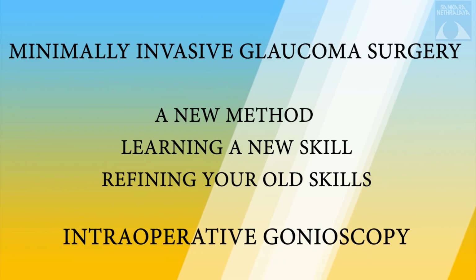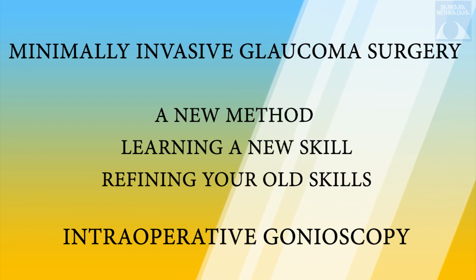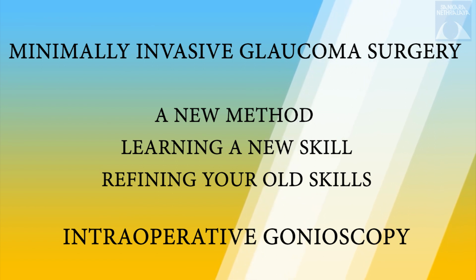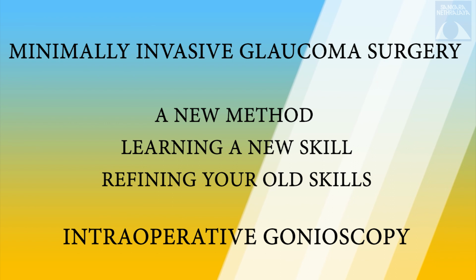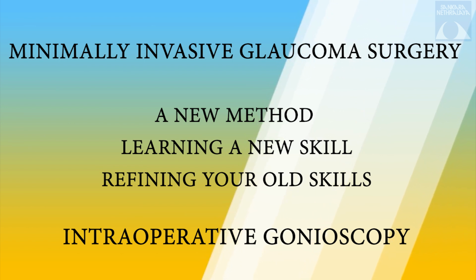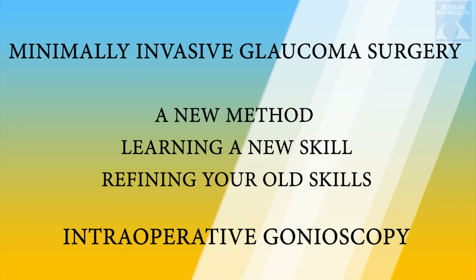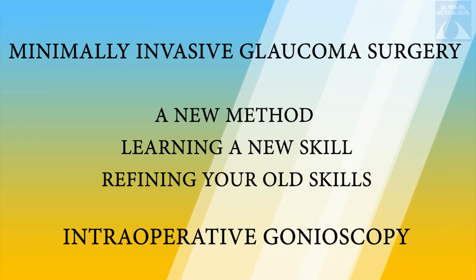Micro-invasive glaucoma surgeries have started to have an impact on glaucoma surgery practice patterns. With constantly evolving newer technology, one needs to learn newer skills and also refine the older ones. Mastering intraoperative gonioscopy is the first and foremost step in learning all types of MIGS. Here I share with you common mistakes and the tips to overcome them while doing intraoperative gonioscopy.